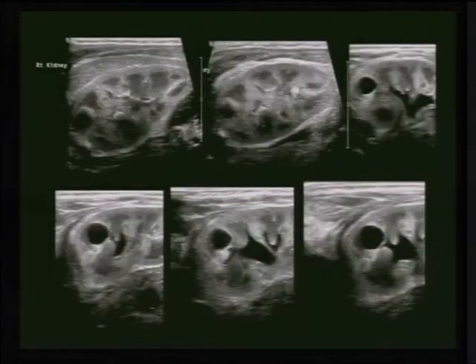How can we say that this is a simple cyst? Be sure that this is a definite diagnosis. If you see that the cyst has a clear margin, very smooth margin, very clear fluid within it, there is no connection to the collecting system, most probably this is a simple cyst.